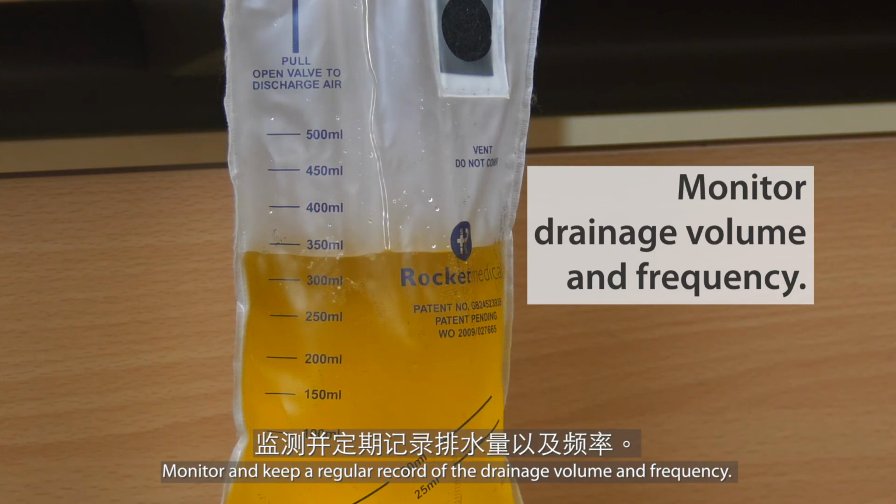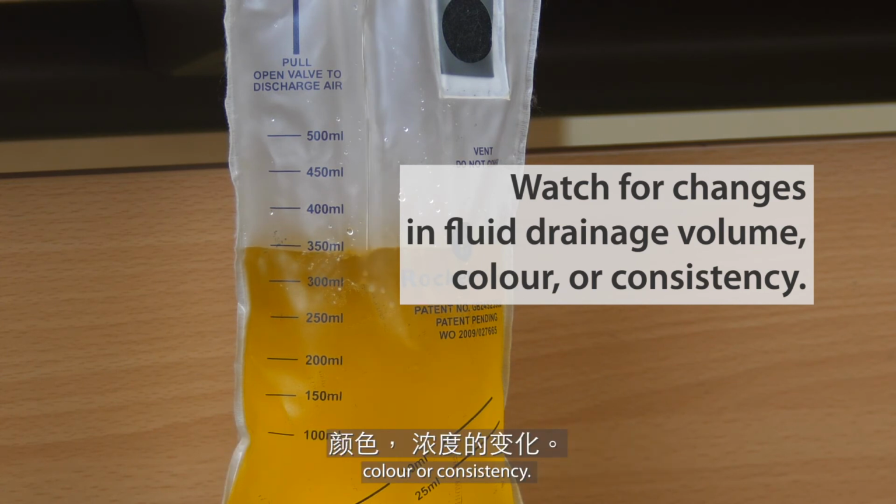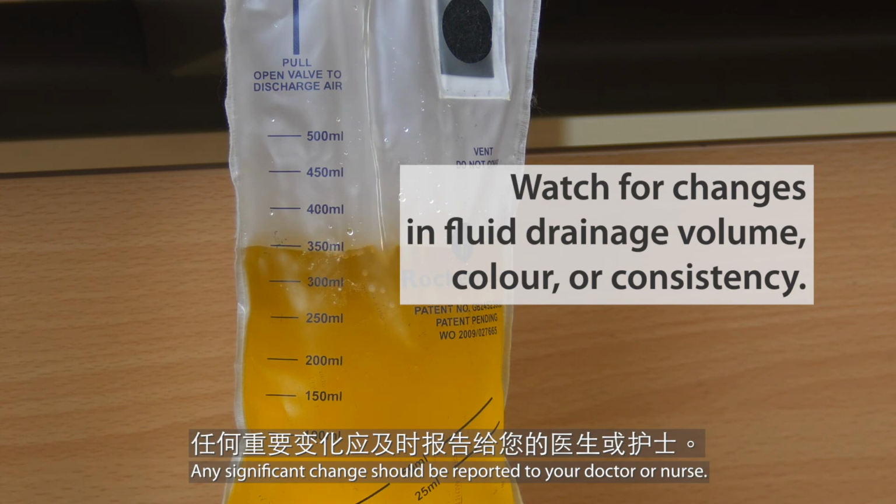Monitor and keep a regular record of the drainage volume and frequency. In addition, look out for any change in fluid drainage volume, color, or consistency. Any significant change should be reported to your doctor or nurse.